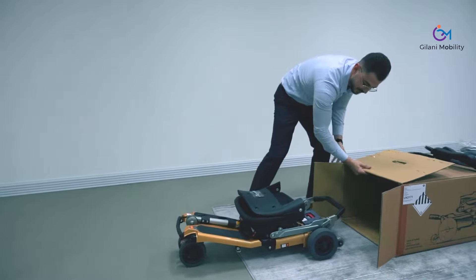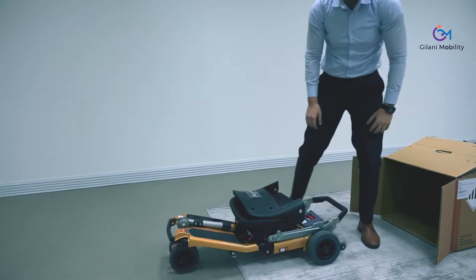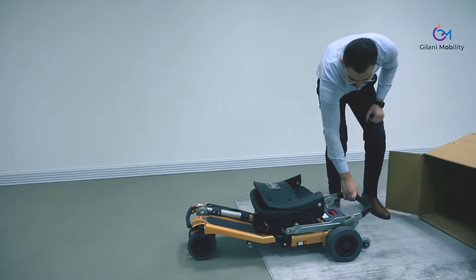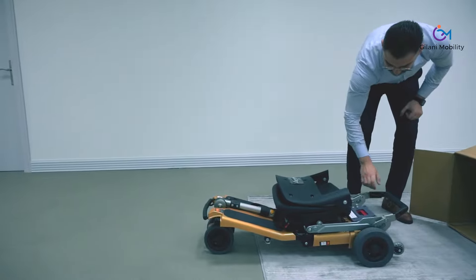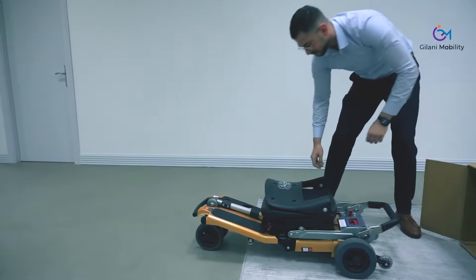The scooter is compact and lightweight, with a fiberglass body and an aluminium alloy lightweight frame structure.